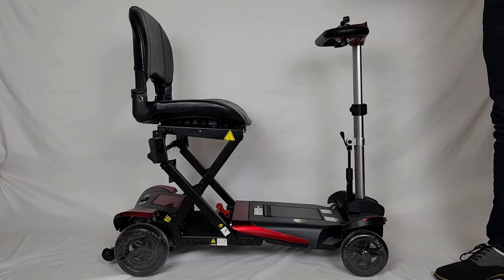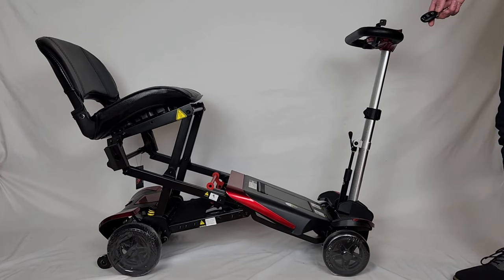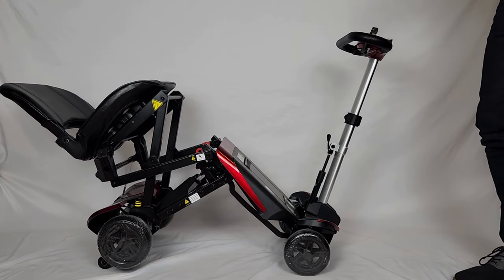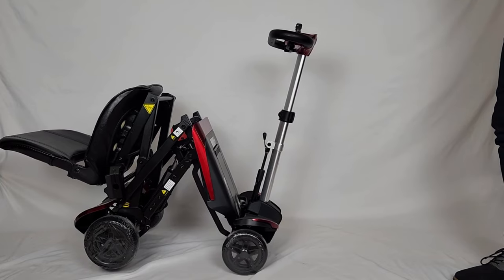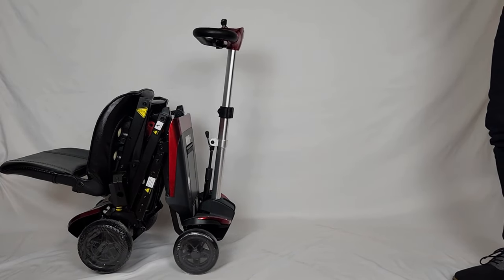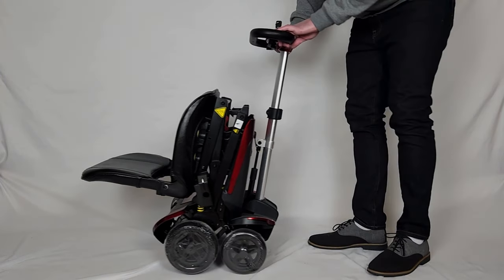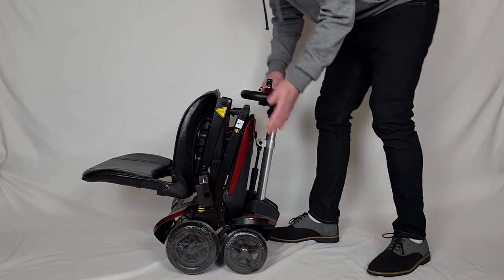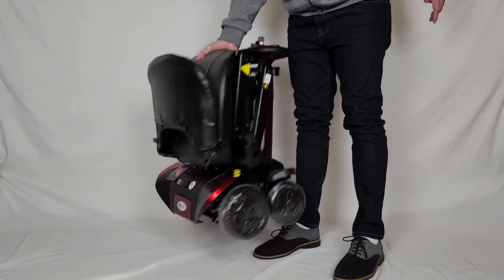At that point you're going to hit the fold button just once and you're going to see that it is going to fold halfway up. Once it stops you're just going to press it one more time. From here if you're ready to store it away you can lower the steering column, pull your seat up — and look how compact that is.